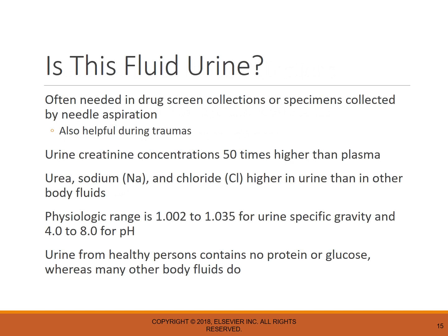At times it has been necessary to verify that the fluid present is actually urine. This may occur in labs that perform urine testing for illicit drugs. In these situations, particularly when the urine collection is not witnessed, the individual may have the opportunity to add a substance to the urine or alter the specimen. Another possibility is that the liquid in the container is not urine. The specific gravity, pH, and temperature can be helpful in identifying urine specimens.